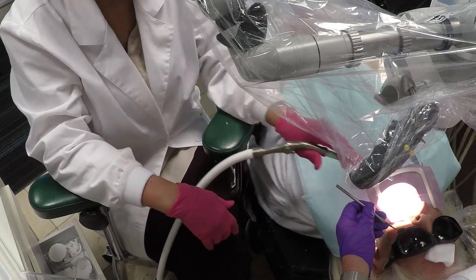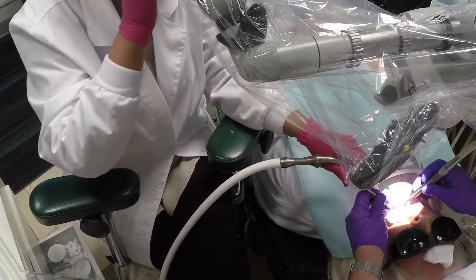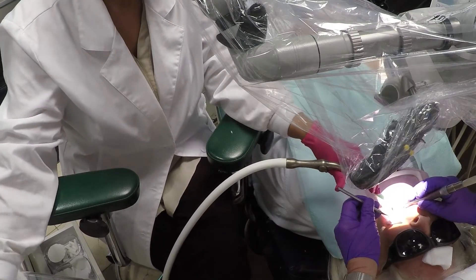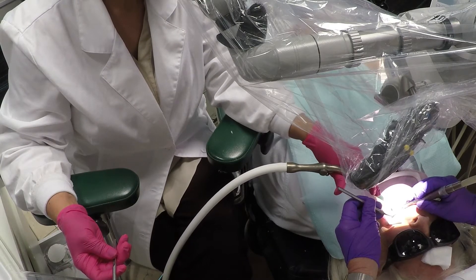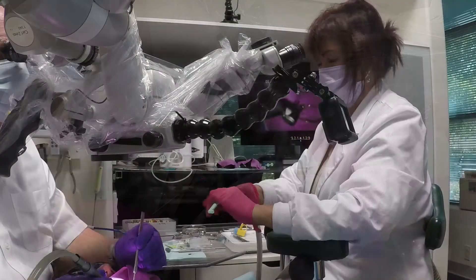Here you can see the space between the chair and the patient's shoulder and arm. It gives a little more freedom because the assistant's scope is moved back. We've actually used two extenders, piggybacked together, and that moves the assistant even further away.